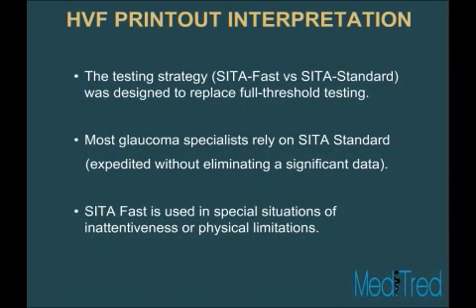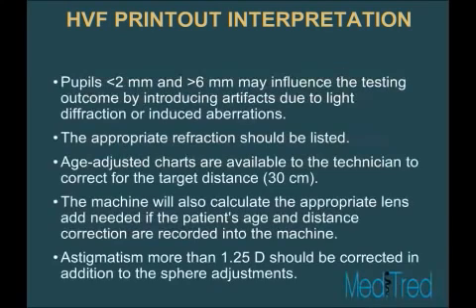The testing strategy, SITA Fast versus SITA Standard, was designed to replace the full threshold testing. Most glaucoma specialists and most ophthalmologists who are following glaucoma patients routinely go with SITA Standard. It's expedited without eliminating any significant data, and that's what we're looking for, as much data as possible, but still making it patient-friendly so that the information is useful. SITA Fast is used in special situations of inattentiveness or in patients who have physical limitations where they can't sit through a very long test.